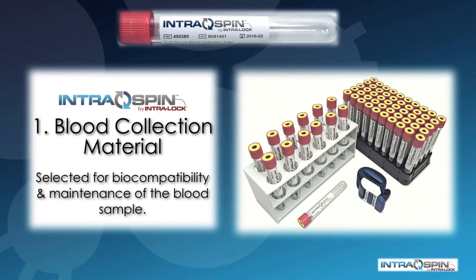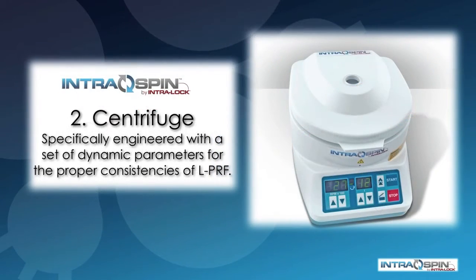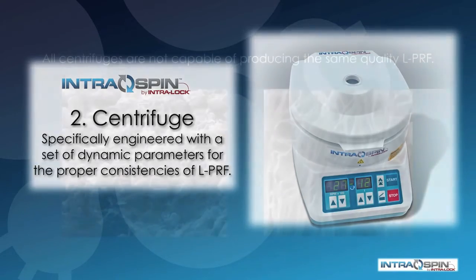Within the IntraSpin system, there is a blood collection material set selected for biocompatibility and maintenance of the blood sample. Next is the centrifuge, a medical-grade device specifically engineered with a set of parameters that will give us proper consistencies of PRF.